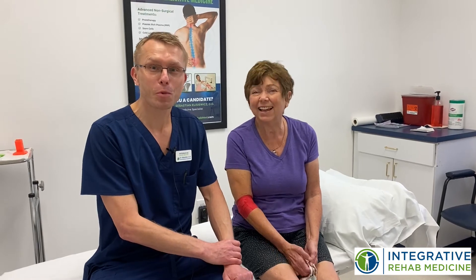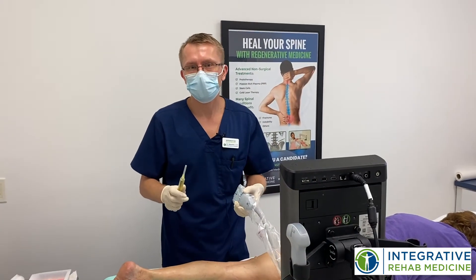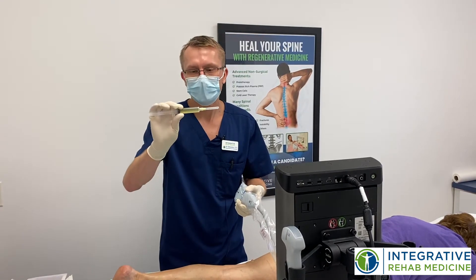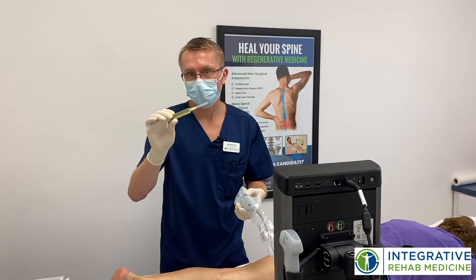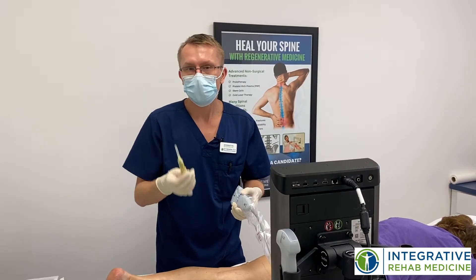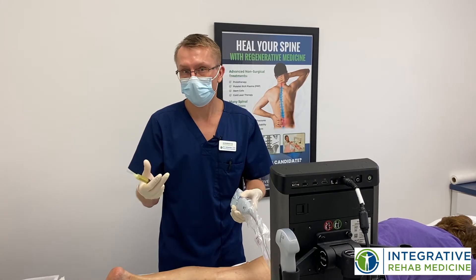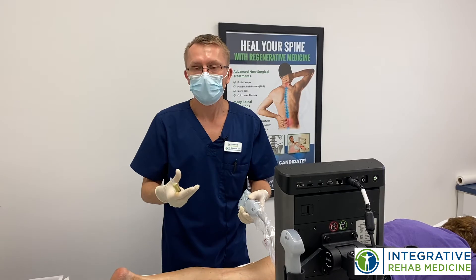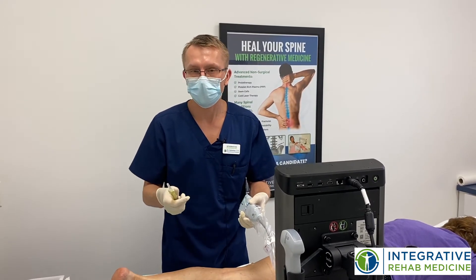Excellent, and we're going to prove them wrong even more today with some platelet-rich plasma. So we're going to get started with the platelet-rich plasma nerve hydrodissection. This is the platelet-rich plasma we created from Lee's blood. It is packed with growth factors and we also mix it with some other ingredients. I'm going to use this to inject around her nerves and hydrodissect the nerves, meaning we're going to put a lot of fluid around the nerves to free them up from any compression, and also provide the nutrients to stimulate the healing process.